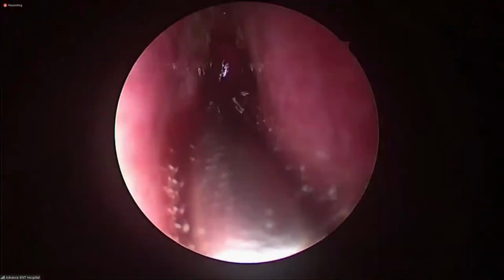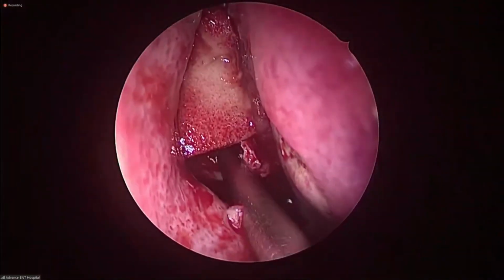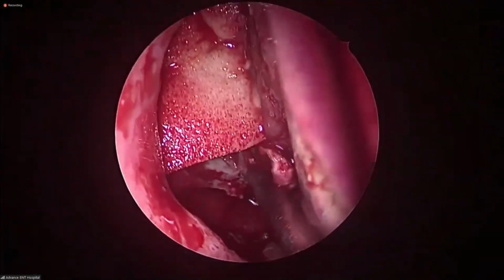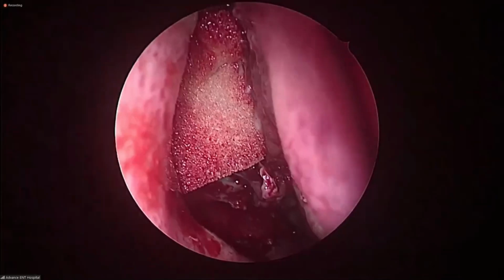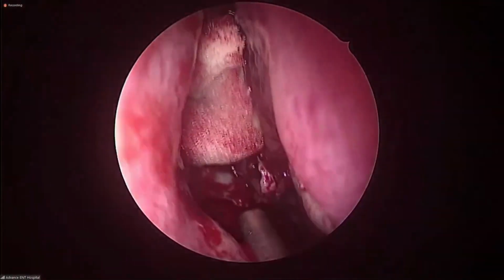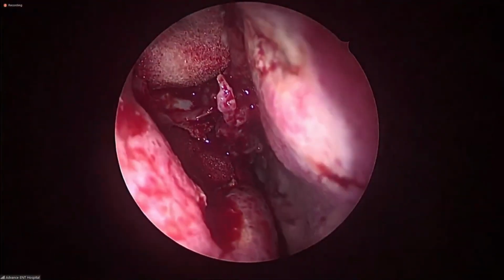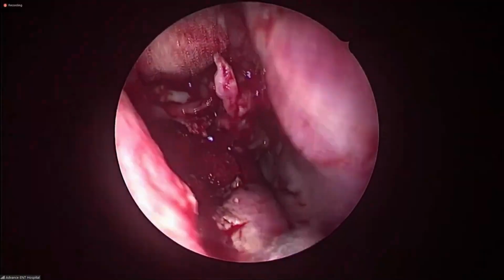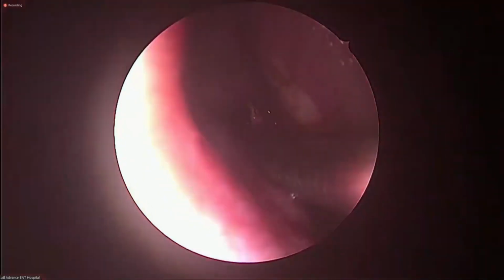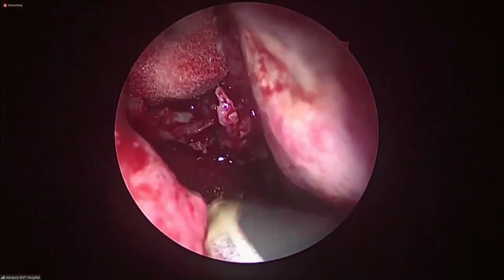And let me decongest it very well because the frontal part I want to show properly. Conditions have improved. Much clearer than before, sir. Imagine initially how depressing the condition was.